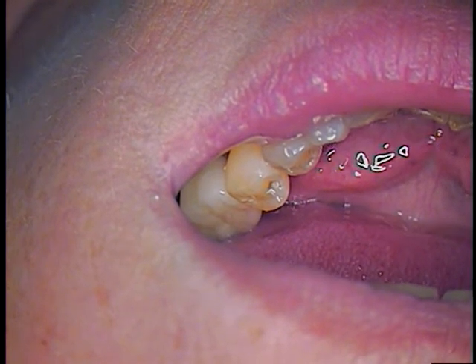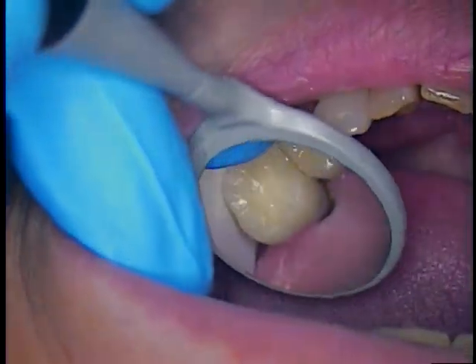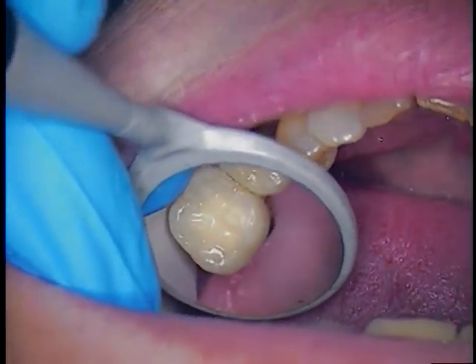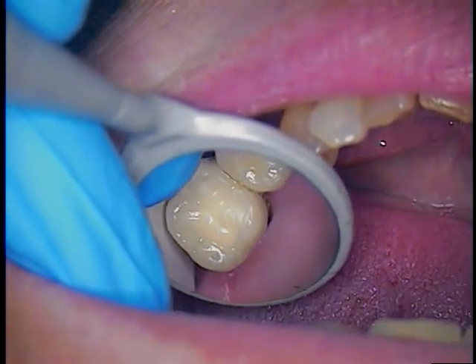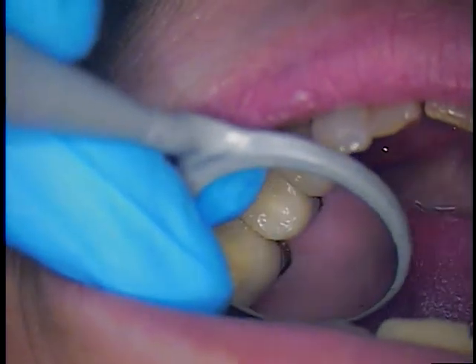So what we need to do is gain access to the screw head. First things first, I'm going to start a pilot access hole through the top of the crown, with the patient's consent, and we're going to go ahead and move along now.